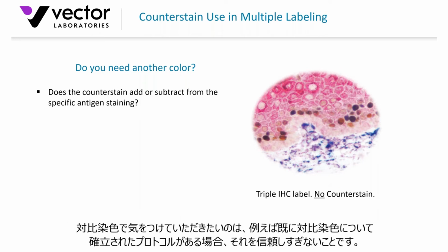So indeed, you have to ask the question about counterstains, and I've got the point here. Maybe you're new to the lab, you're following an established SOP. Try to question a little bit some of the methodologies in place. Indeed, I've got here, don't be a victim of lab dogma, whereby I've fielded inquiries, people saying, well, we've always done it this way.